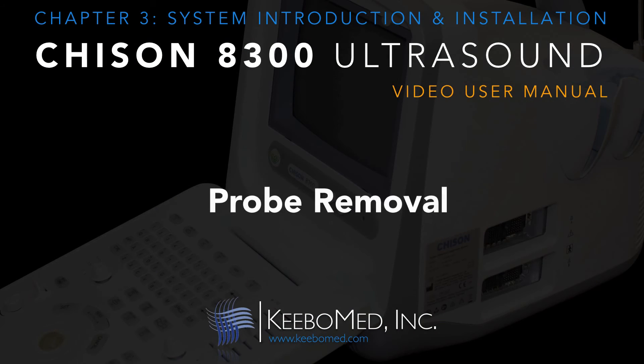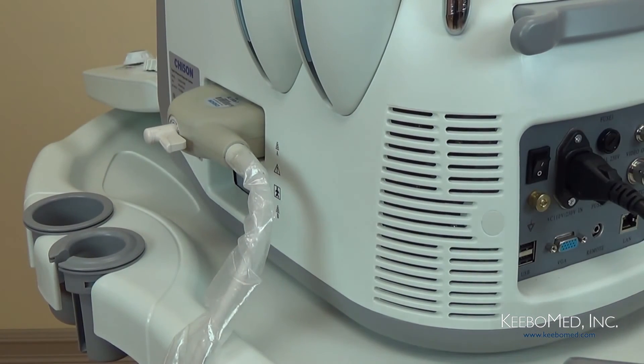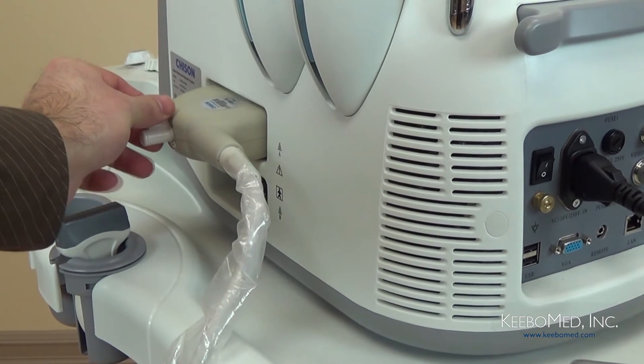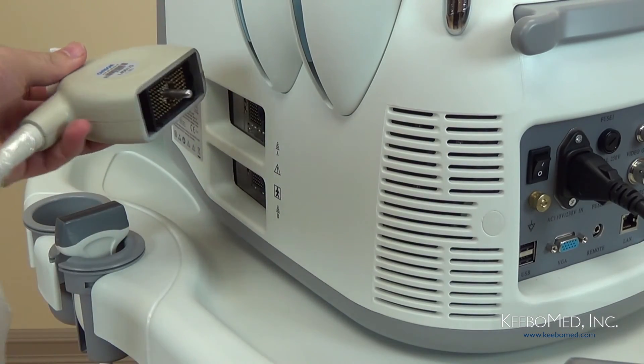Let's now review the proper way to remove the probe from the system. First, turn off the unit and put the probe head inside of the probe holder. Second, turn the lock knob in the counter-clockwise direction to the open position and then remove the probe carefully from the probe socket.